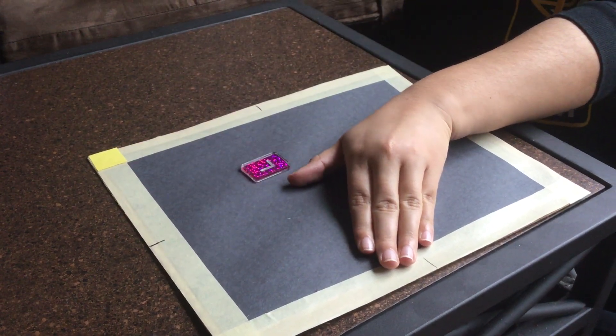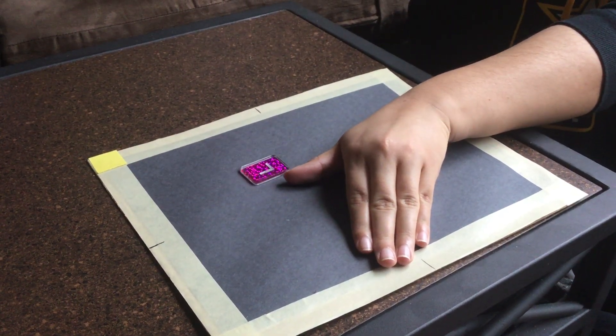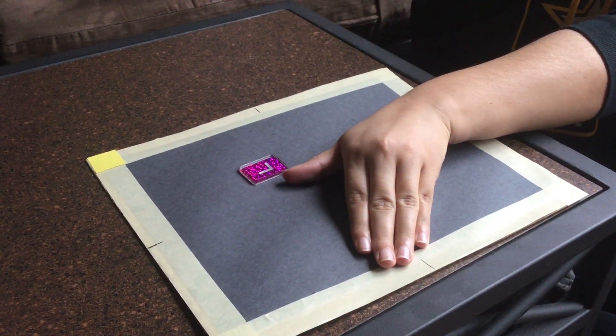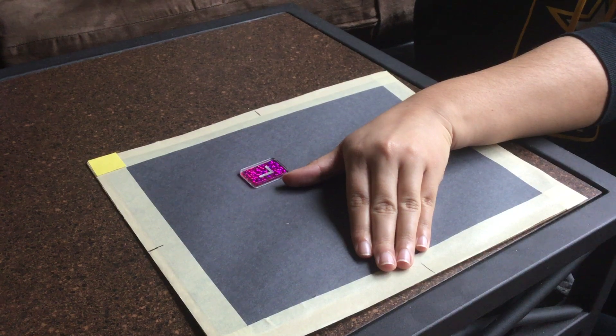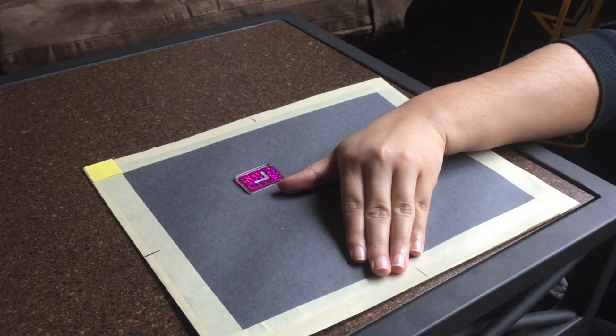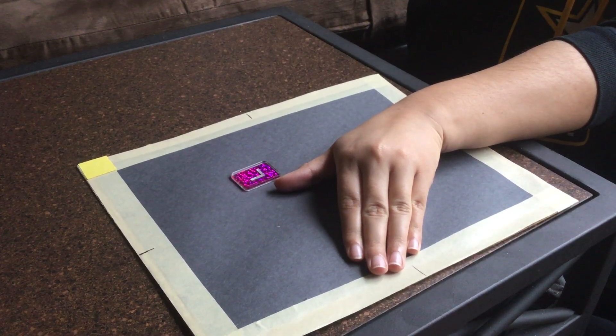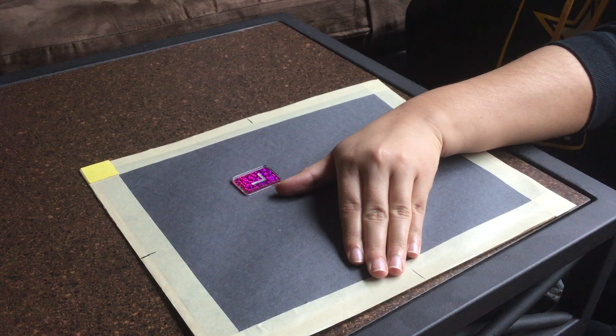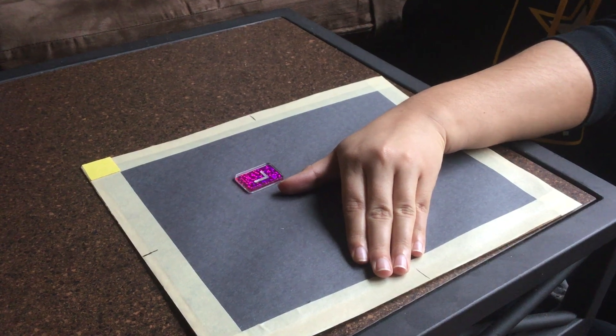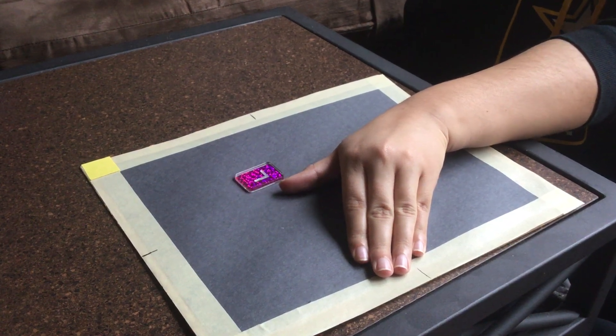The central ray is going to go through the first metacarpophalangeal joint, and we're going to collimate around the thumb. Okay.